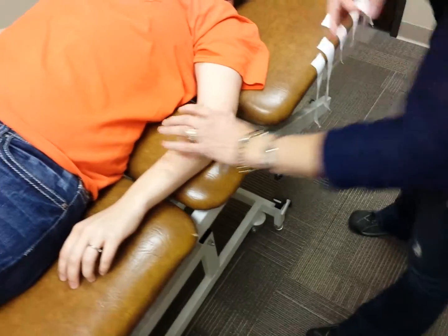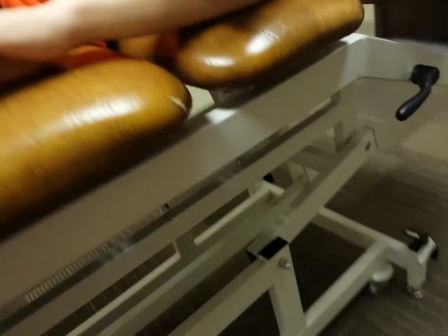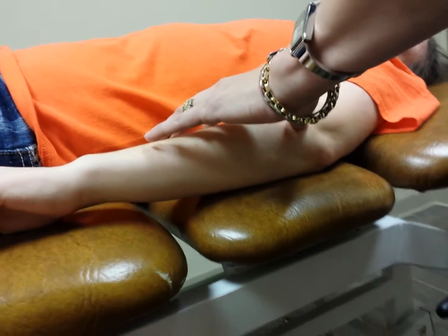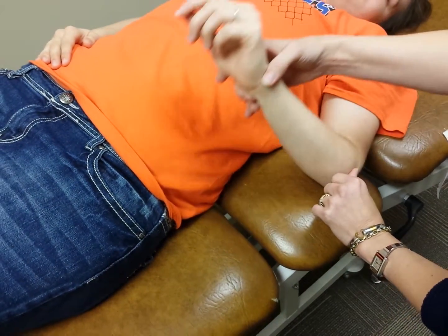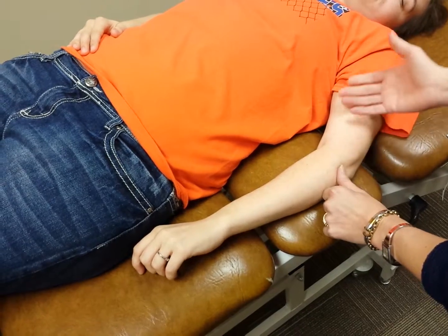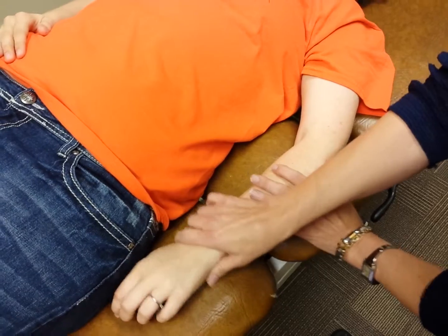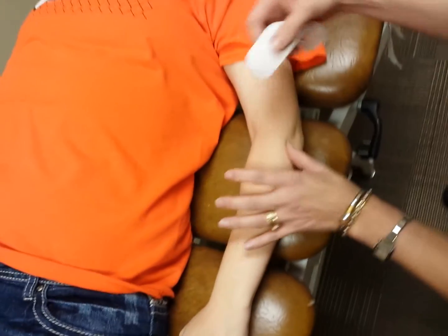First I'm going to find where the lateral epicondyle is. Before taping, I need to find out if the pain is greater in flexion or greater in extension. If it's greater in flexion, I want her in a more extended position, and vice versa. In this case, the pain is greater in flexion, so I'm keeping her in a slightly extended position, with my finger right where the lateral epicondyle is.